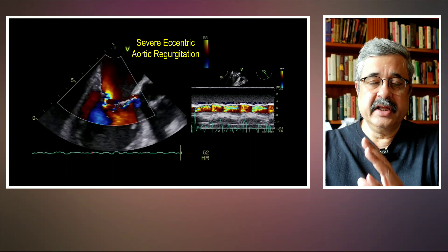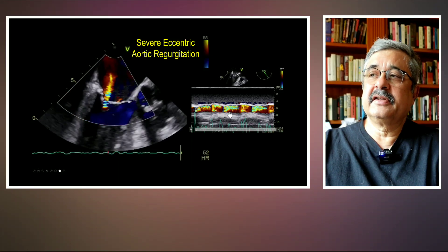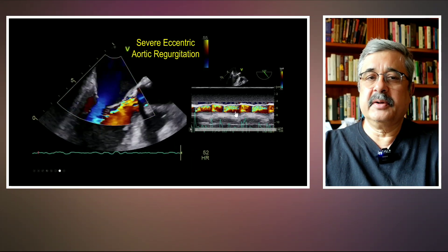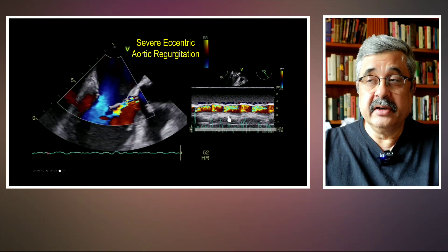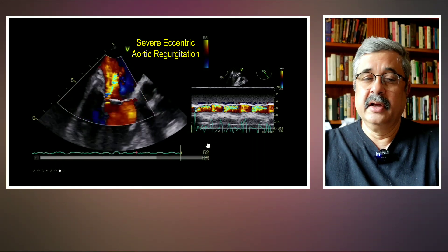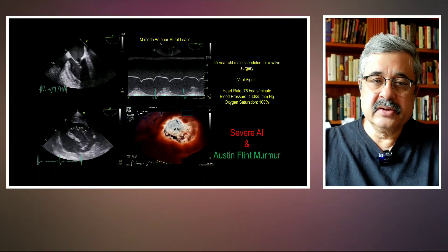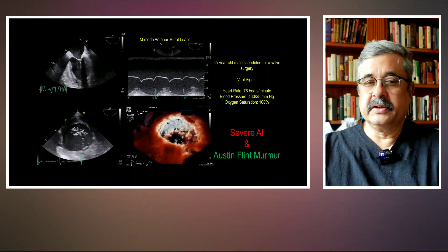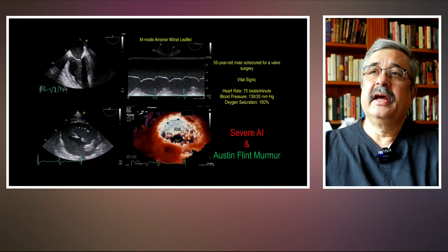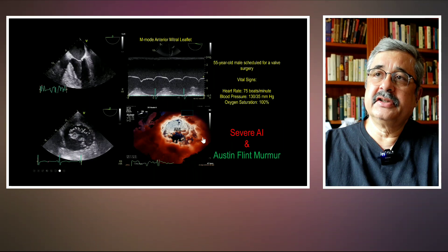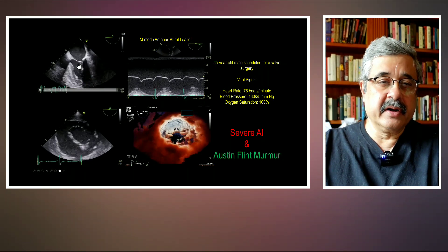It's actually more than that, but you don't see it as clearly because it's all eccentric — it is all hitting the anterior mitral leaflet and sparing the interventricular septum. So this is severe eccentric aortic regurgitation. There's also another peculiar feature: this is known as the Austin Flint murmur, which is a murmur of severe aortic insufficiency produced by the aortic regurgitation jet hitting the mitral leaflet, leading to high-frequency fluttering of the mitral leaflet.